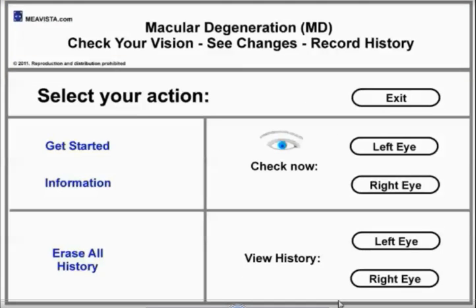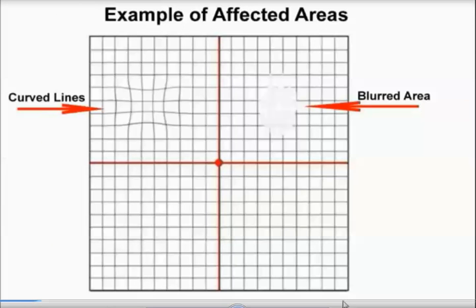The Mea Vista program helps to detect signs of macular degeneration, to identify and mark an affected area, and to see changes. Easy download and installation to your computer. It only takes seconds to check your vision and see changes of an affected area. A common symptom of macular degeneration is the presence of curved lines or blurred vision area in your vision, as shown in the example.